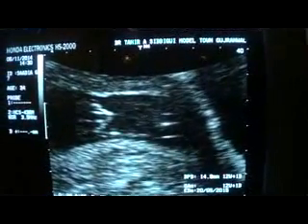We will call this fetus number one because it is close to the os. The fetus that is close to the os is labeled as fetus number one in multiple pregnancies. This is the placenta. It is at an early stage — almost previa or marginal.